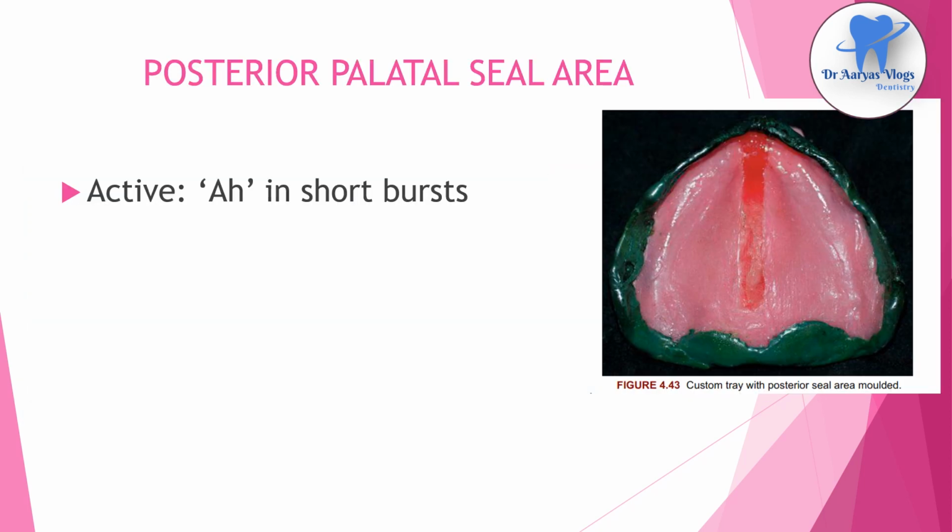And the posterior palatal seal area is recorded. The patient is asked to say ah in short bursts to record this area. So this is the custom tray with the posterior seal area molded.